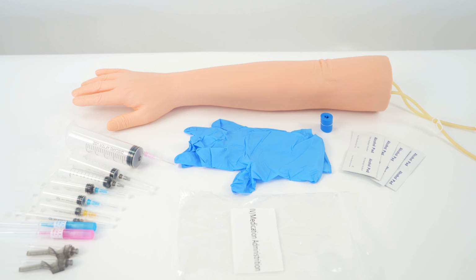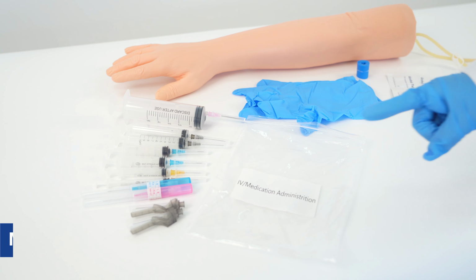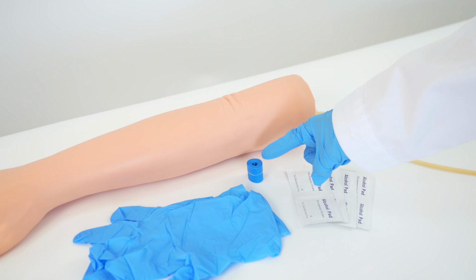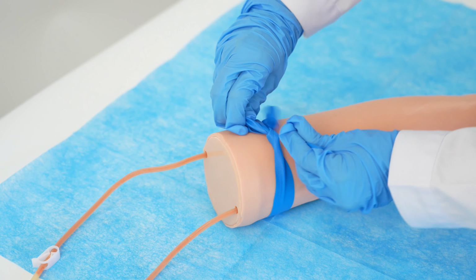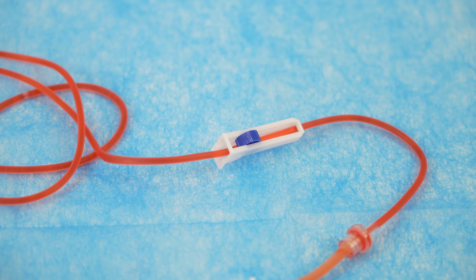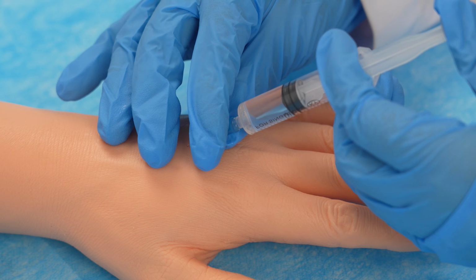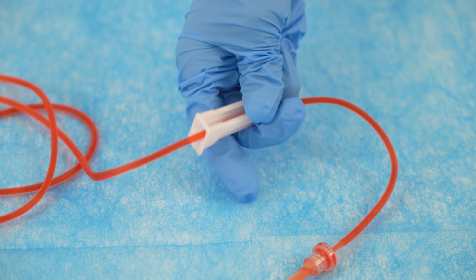For our 3rd scenario, we will practice medication administration through the IV. Here's what you'll need: IV medication administration bag, gloves, tourniquets, alcohol pads. Ensure the IV line is open and adjust the arm's position if necessary for easier access to the IV site. Clean the medication vial and prepare the syringe. Administer the medication slowly into the IV line, mimicking the technique used in real clinical situations.